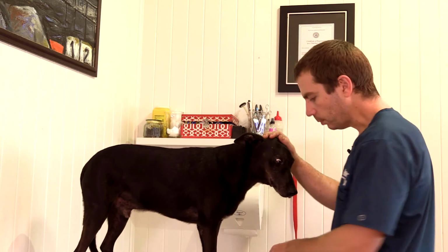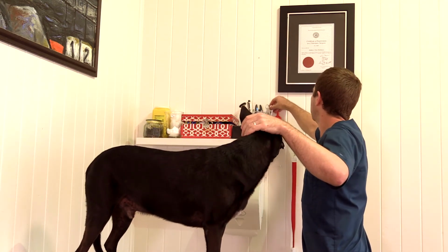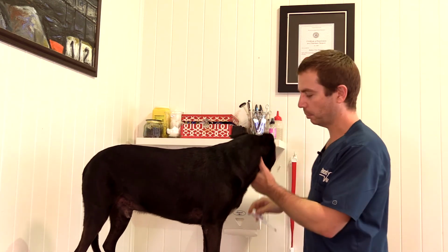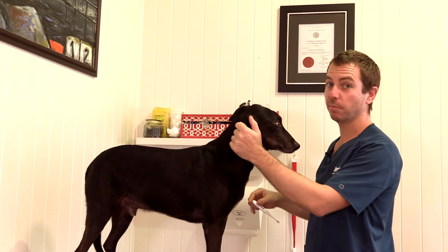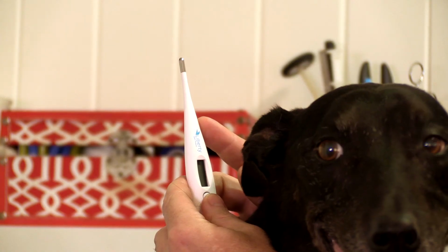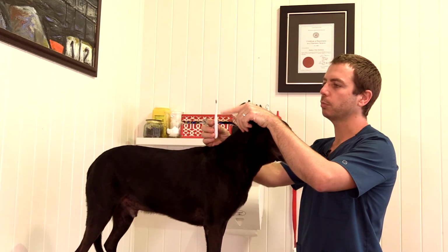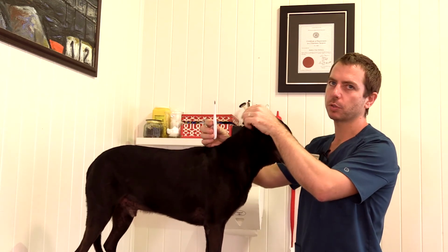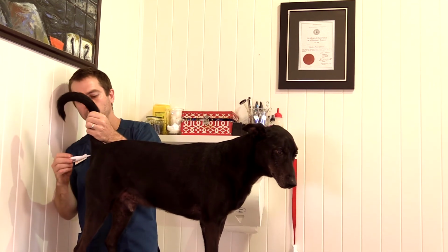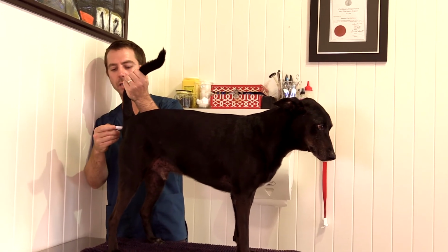And then we would move on to taking a temperature. So dogs are really lucky in that they all get to be penetrated when they come to the vet, unless they're bitey. Same with cats. You need to stick the thermometer in 3 to 5 centimetres in a dog this size. If you put it in 1 centimetre, it's going to be wrong. If you put it inside fecal material, it's also going to be wrong. So we really want to get it right in there. A bit of lubrication is good. Get it right in there, push your button.